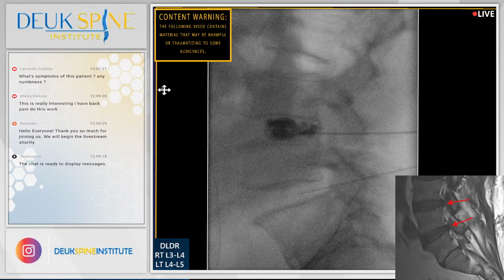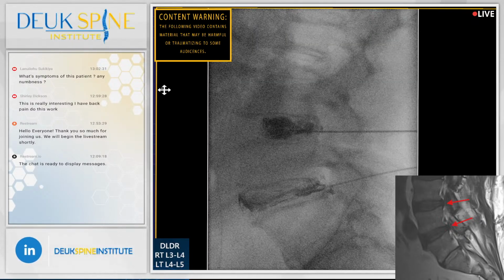All right. How bad is that on a scale of 1 to 10? 8. Another 8. Is that where you get back pain? 8 out of 10, and it's concordant. All right, my friend, when you wake up, that pain will be gone. I want you to count out loud from 1 to 100. Count out loud from 1 to 100 so I can hear you.